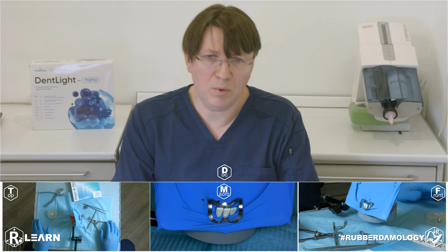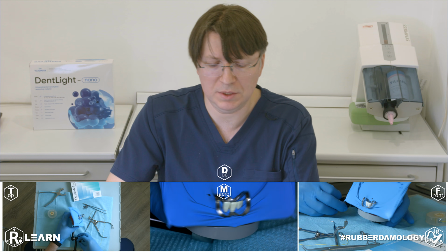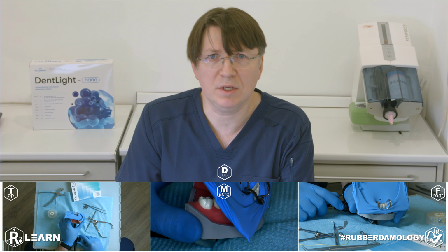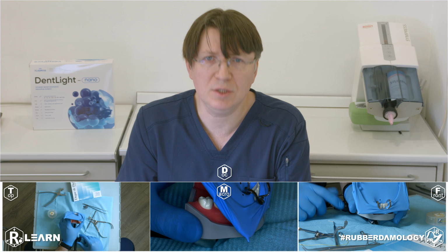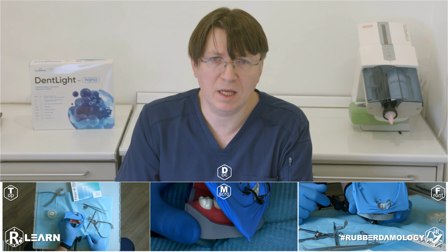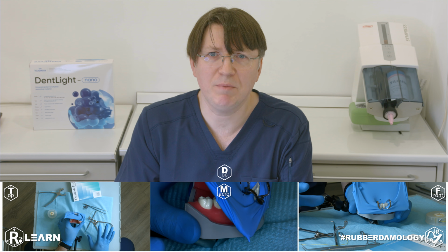We finish our work today. Thank you for your attention. I hope you have enjoyed seeing that rubber dam is a very fast technique. You don't need much time, many different accessories, or types of clamps to make isolation on one tooth, no matter what type of tooth, in the oral cavity of your patient. One tooth, one clamp, one perforation. Sometimes 3 perforations.